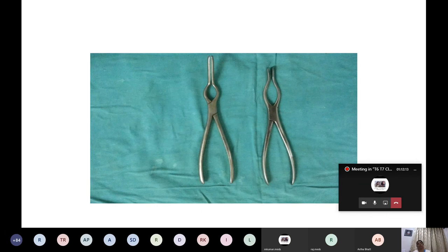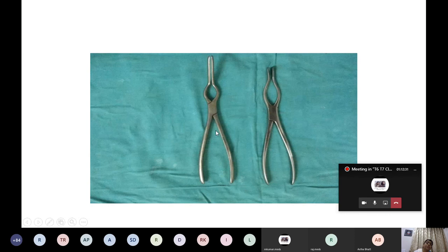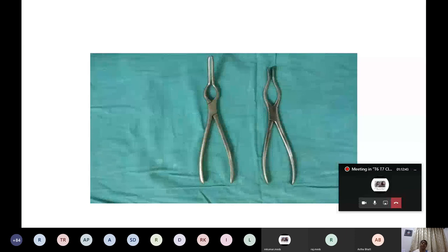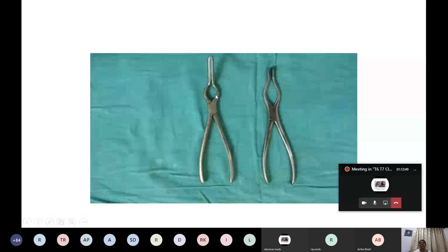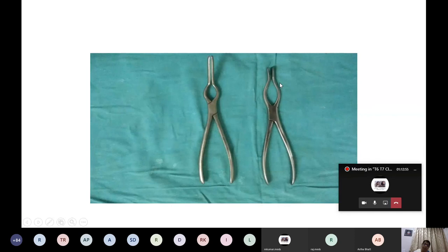Walsham's and Ash forceps are commonly asked in practicals. Ideally, one blade of Walsham's forceps should be covered with a rubber catheter, which comes on the skin. The Ash forceps is used for septal fractures — there is a gap between the two blades to hold the cartilage without crushing it. Walsham's forceps is used to elevate nasal bone fractures, with the rubber-covered blade on the skin surface.